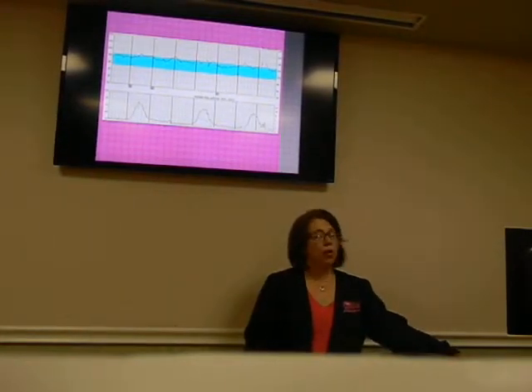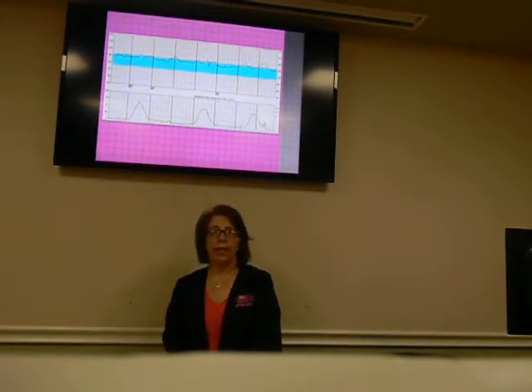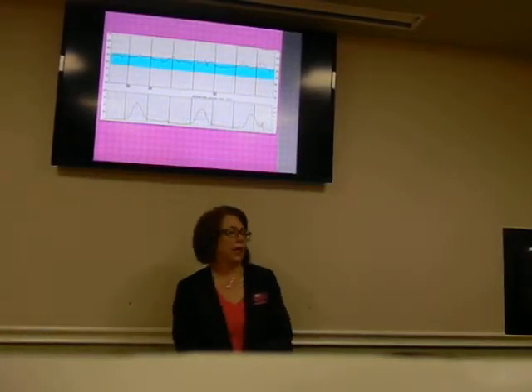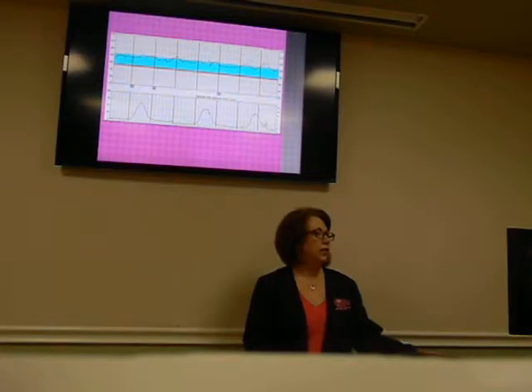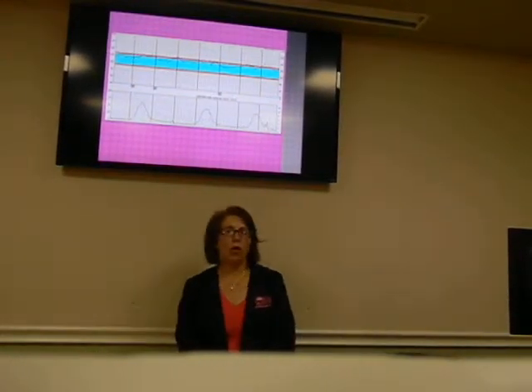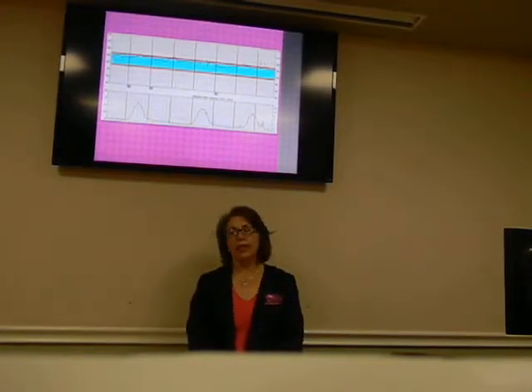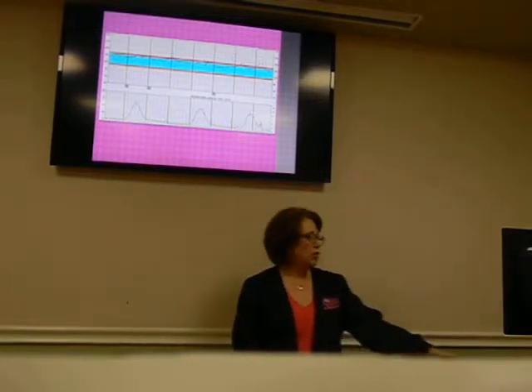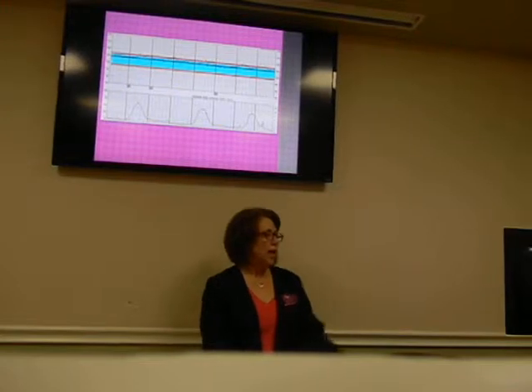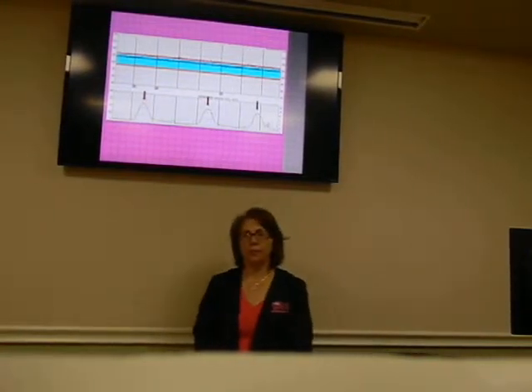So according to Kathlene Rice-Simpson and Patricia Meehan in the text Perinatal Nursing, a normal fetal heart rate is between 110 and 160. The tracing, or the baby's heart rate, is a squiggly line, which is the average over time, and it's called the baseline, which is represented there in that line. Now, the rolling hills at the bottom are contractions.